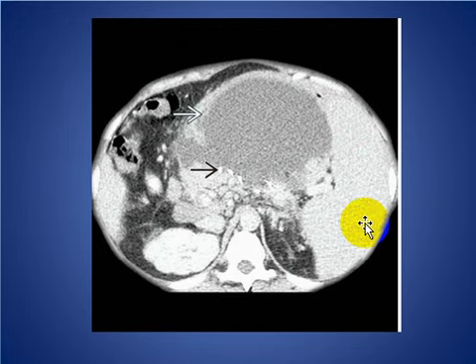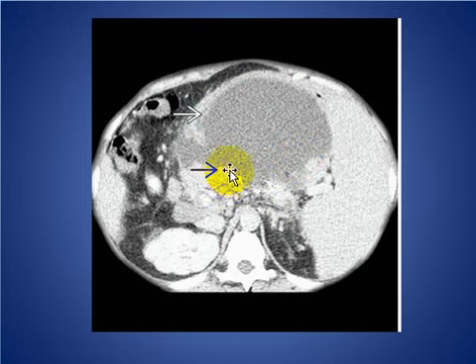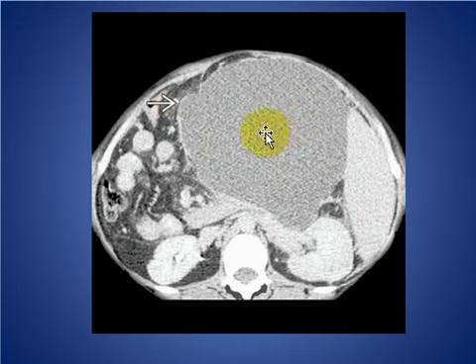Here is a patient with a large cystic mass and a surgical splenorenal shunt performed for portal hypertension and cirrhosis — proven to be a lymphocele at surgery. We see surgical clips in that area, splenomegaly, and varices. The same patient also shows a urinoma at the splenorenal shunt area in the setting of cirrhosis.